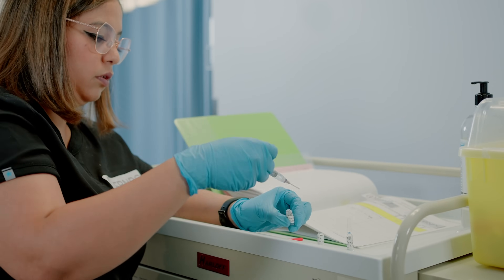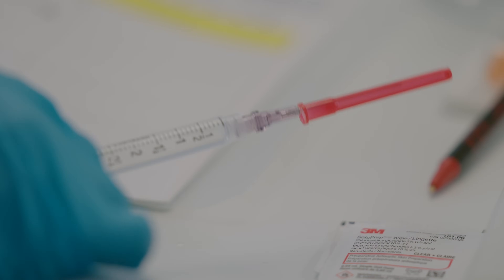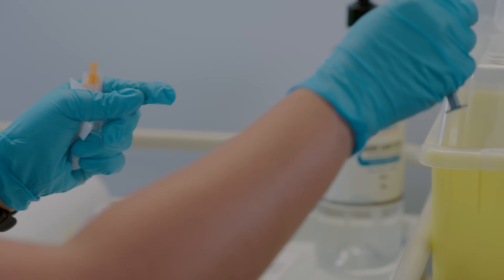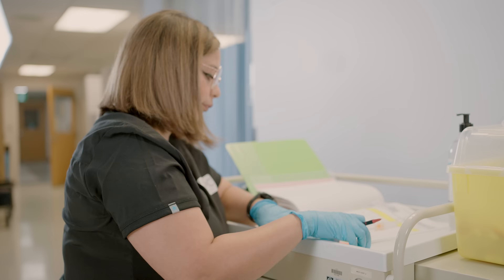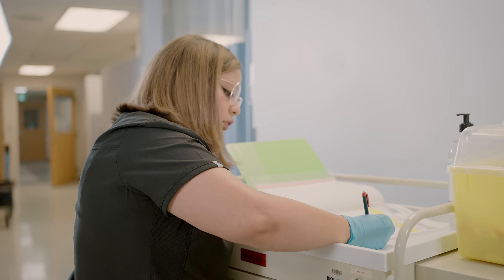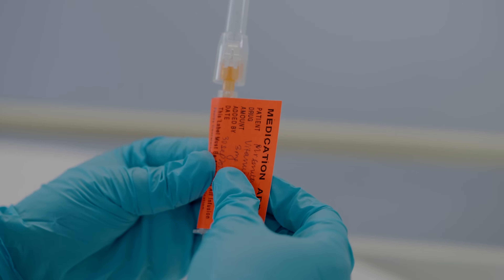Now that you have withdrawn the amount needed to administer to your patient, you can safely recap your needle with the scoop technique. Then remove the needle and dispose of it in the sharps container. If you are not administering this drug right away, you must label the syringe with the drug name, dosage, date and time, and your initials.